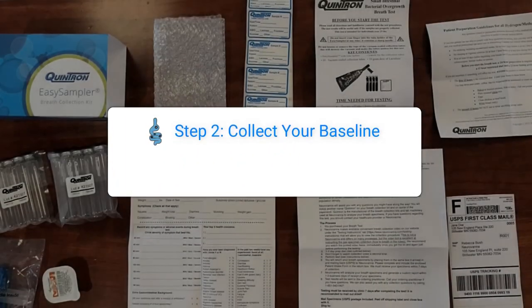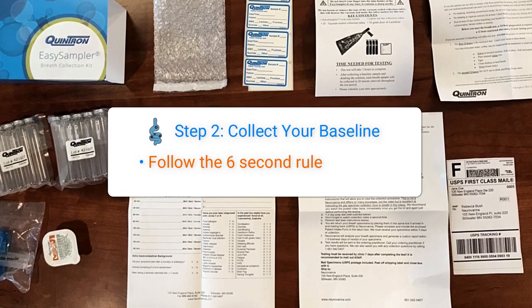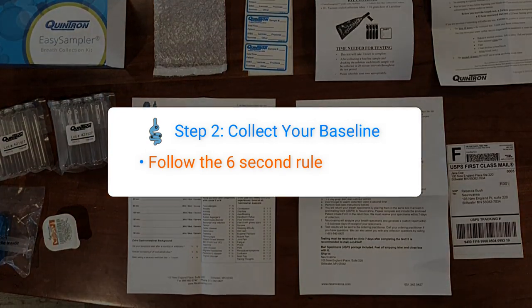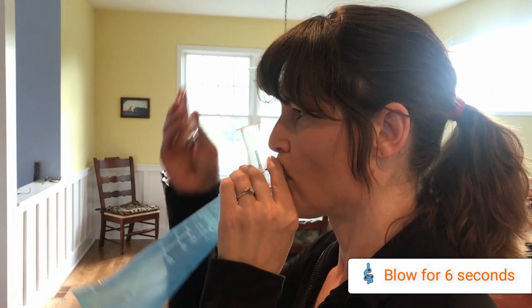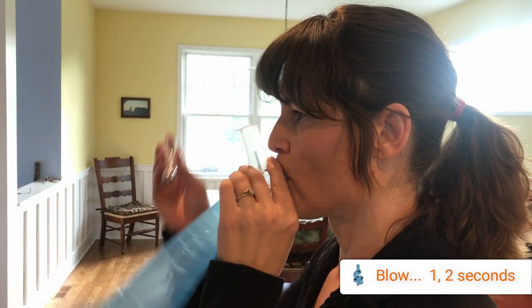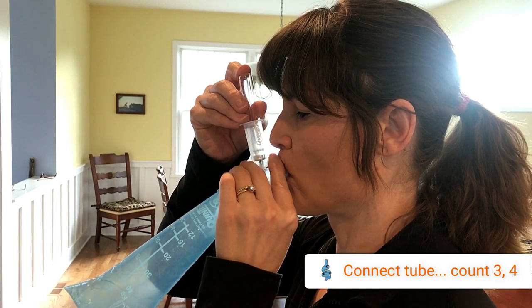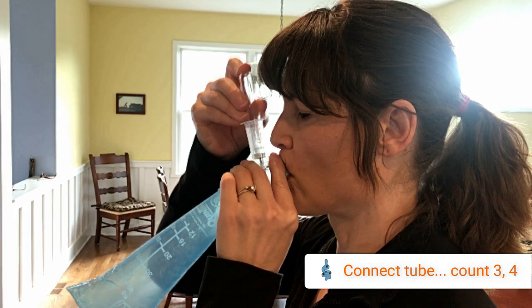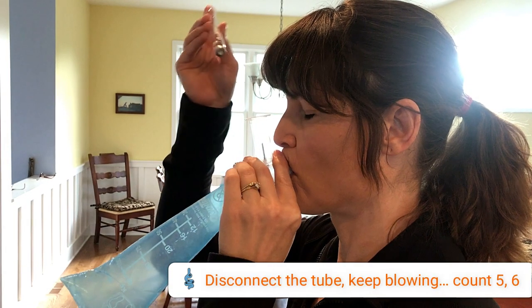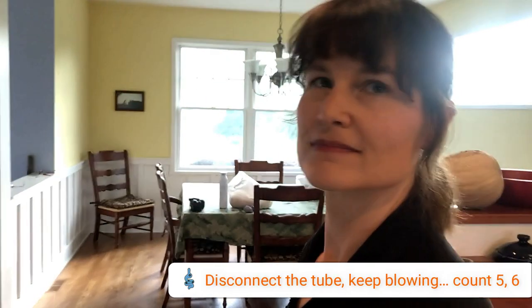Collect your baseline sample by breathing into the Quintron Easy Sampler. Follow our 6-second rule to ensure a proper collection. Blow into your Easy Sampler for 6 consecutive seconds while collecting your breath specimen. Start by blowing for 1-2 seconds into the Easy Sampler bag. Press the collection tube into the tube holder hard enough to break the rubber seal with the tube holder's needle and count 3-4 seconds. Remove the tube from the tube holder while still breathing and count 5-6. Now you are done.